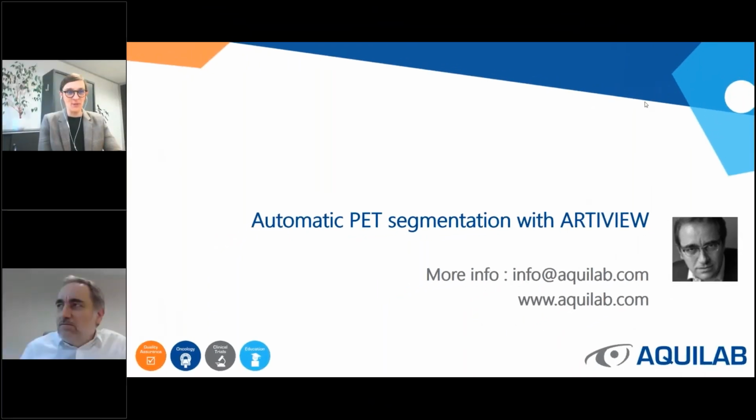Yes, thank you. So we had a couple of questions regarding your presentation. The first one is, can we use the solution without doing calibration of the PET? Yes, of course, but in that case, you will be restricted in the number of methods you can include in the consensus. Of course, you will not be able to use the methods which require the calibration.